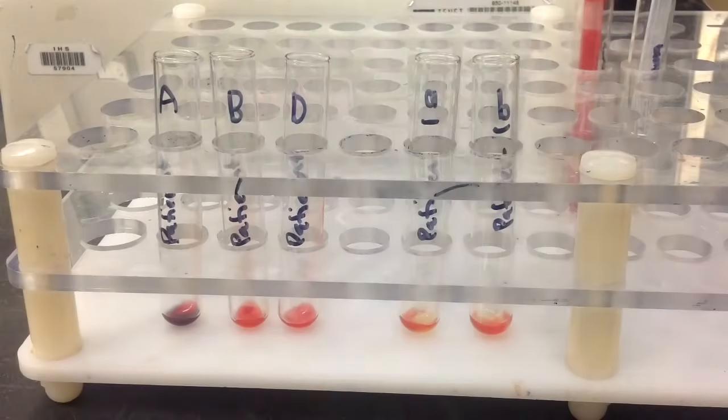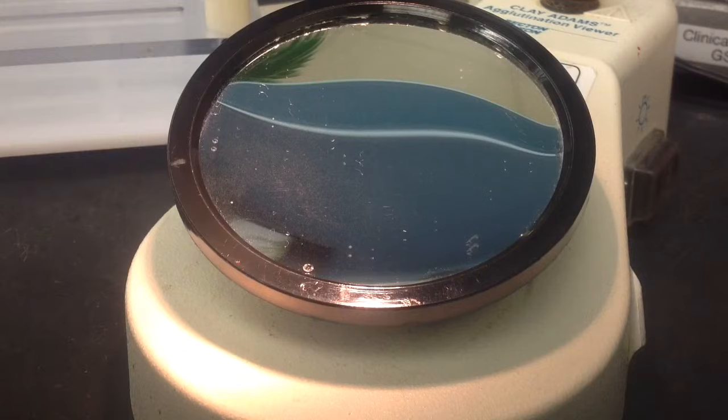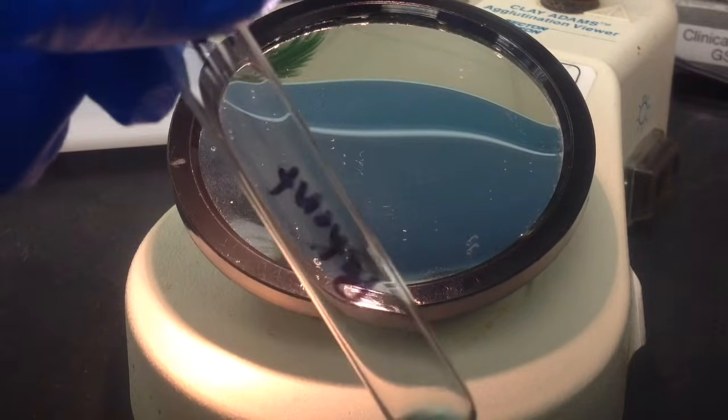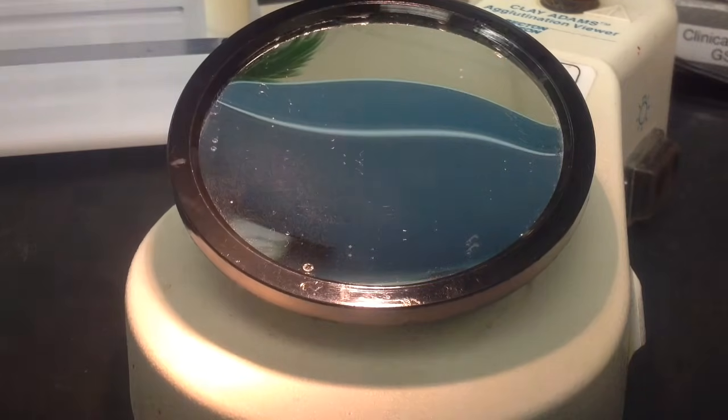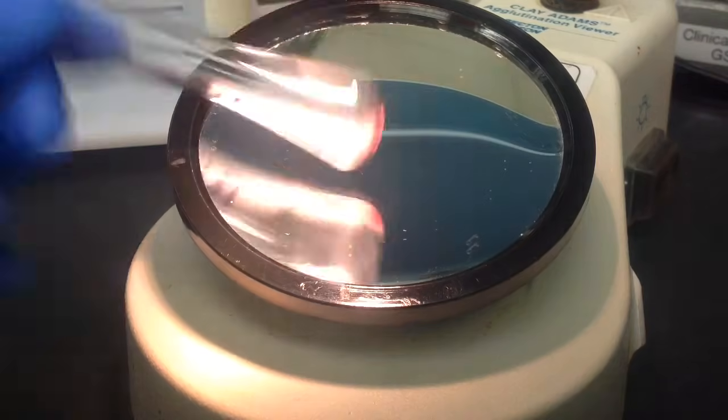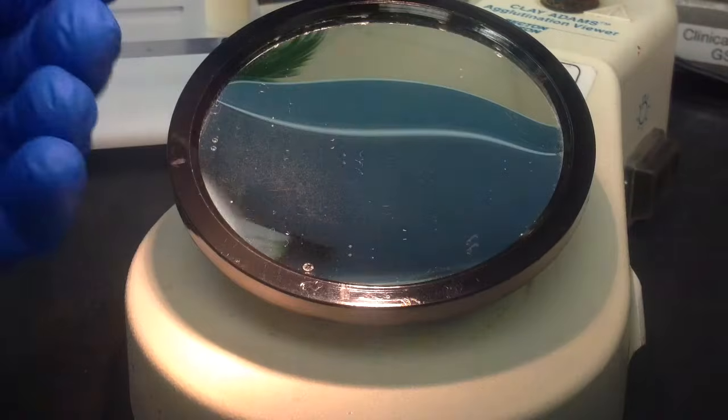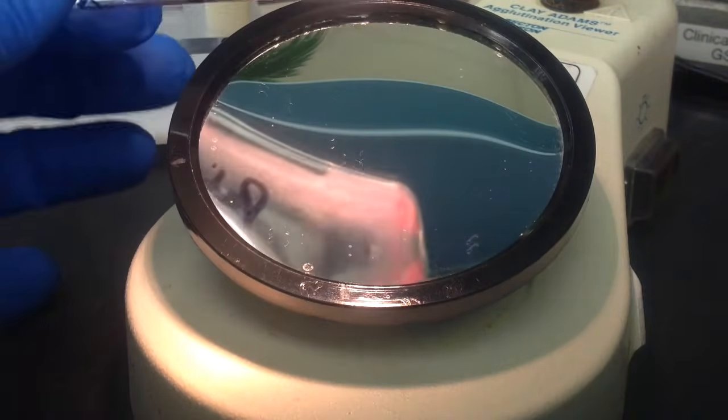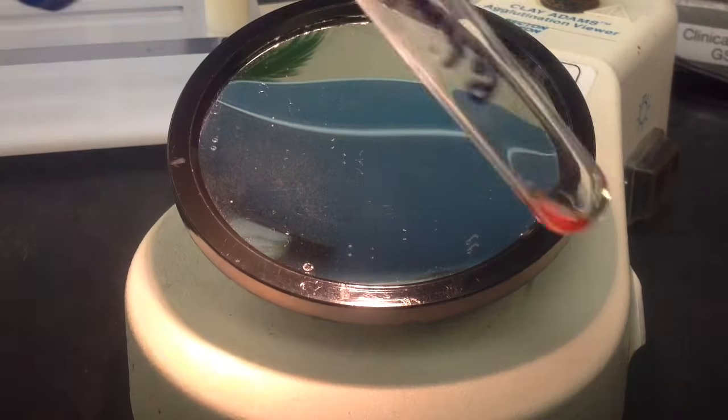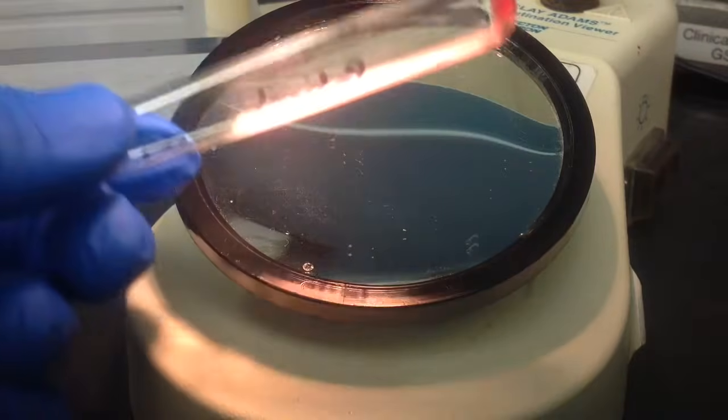And after you've added your patient specimens to each of the tubes, you go ahead and centrifuge this. And then we'll move on to the agglutination viewer. And what you're basically trying to do here is to gently resuspend the cell button and just remove it from the bottom of that tube. You can see there, we're getting a zero reaction. All of the red blood cells from the cell button are completely clean off. There's no agglutination.